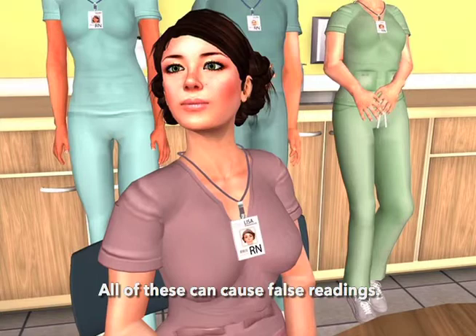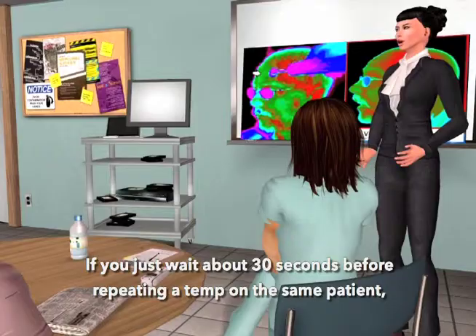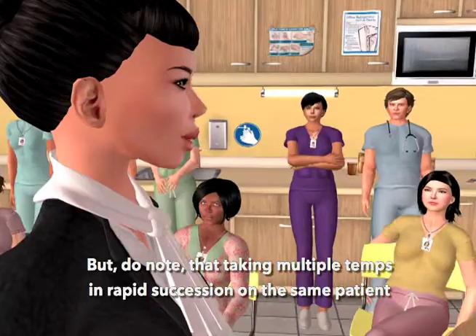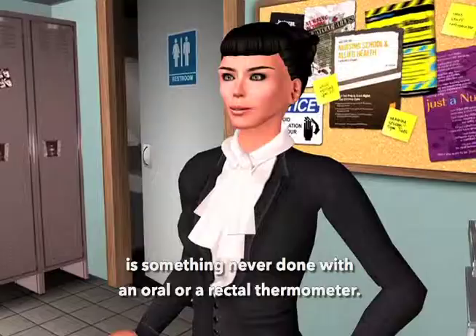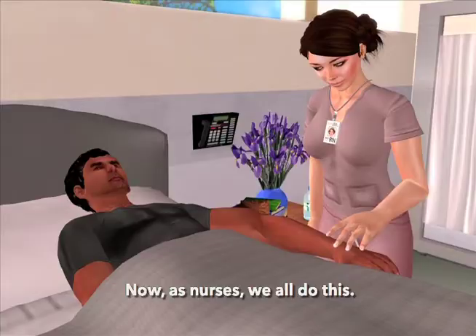Why are multiple temps an issue? The cold probe is going to cool the skin, and skin is part of our measurement. If you wait about 30 seconds before repeating a temp on the same patient, you'll be fine. Note that taking multiple temps in rapid succession on the same patient is something never done with an oral or a rectal thermometer. As nurses, we all rely on the accuracy of touching the patient — palpation — to determine fever.